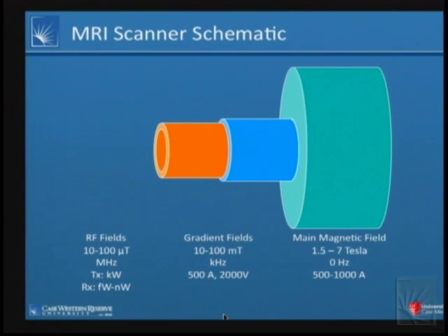Incredibly stable. Inside this is a superconducting magnet. There's anywhere between 500, and this is a little bit old slide, there should be about 2,000 amps in some of the higher end ones. So this is really a complicated device. We have these gradient fields, which are the fields that we use to do our encoding. These are in the range of 10 to 100 millitesla per meter, and they now have switching rates in the audio range, in the kilohertz range. These are driven with 500 amps, 2,000 volts. So that's a megawatt peak per axis in our current system today.